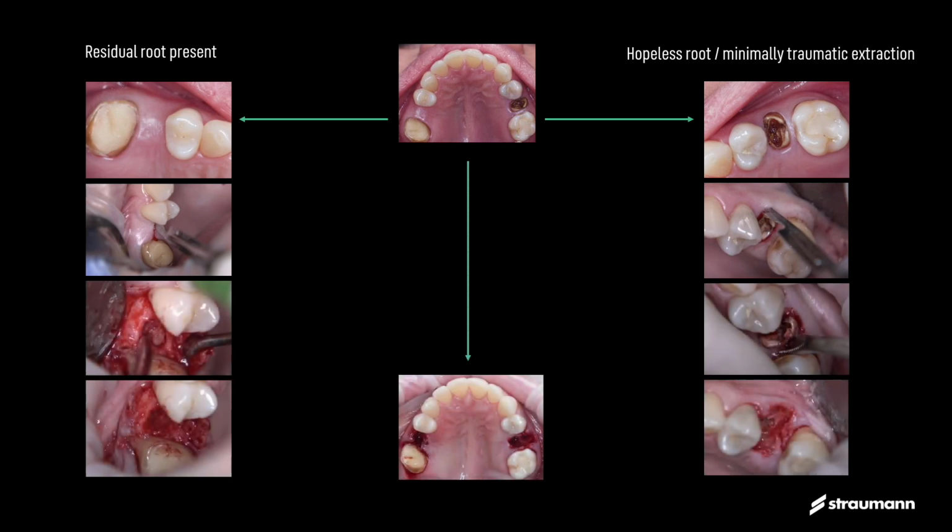So you see on number 15, as I told you, there will be a surprise. On the CBCT, even though it looks like a healed site, I noticed there was a residual root trapped underneath that soft tissue. The tissue looks pretty good, but there was a residual root there. So in that case, I made a crestal incision, I opened the flap, and then I started the procedure to remove that root.